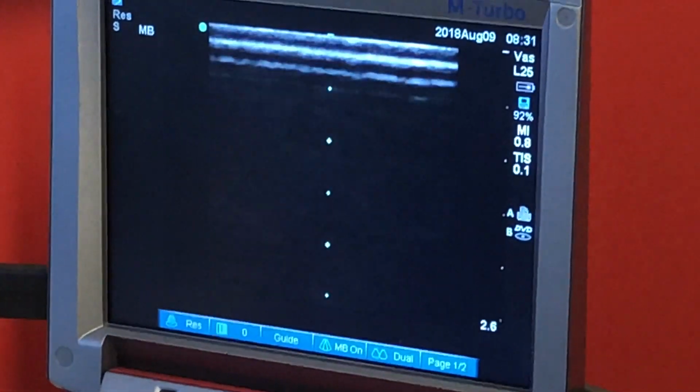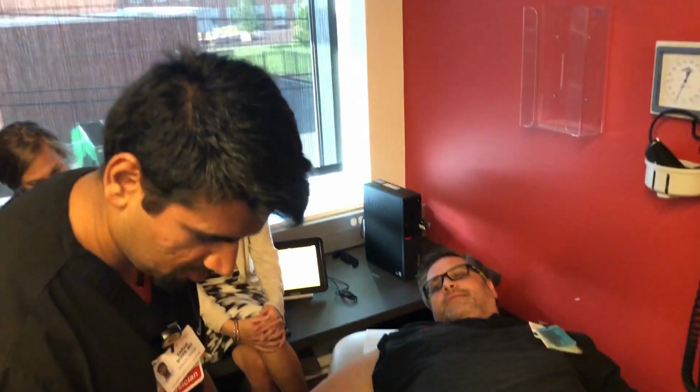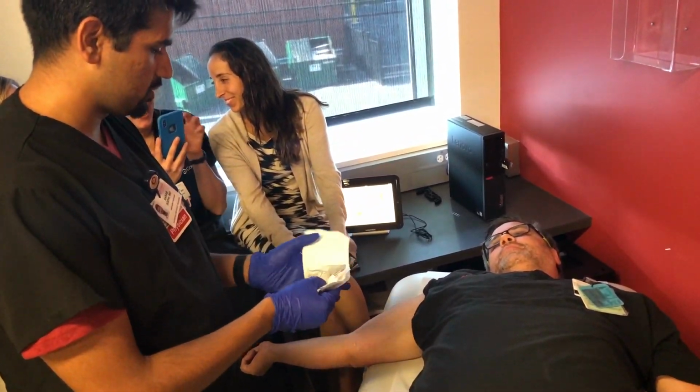So what we can do, Dr. Byrne, do you have a preference for site? Okay, basilic, that's fine. All right. Basilic's usually a really good target, usually big. Yeah. That's the idea. And let us know how the experience is from the patient perspective as well.